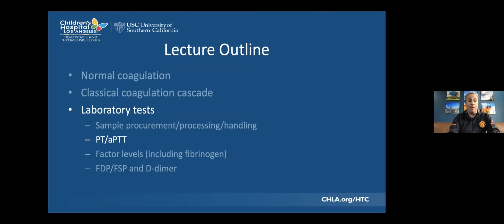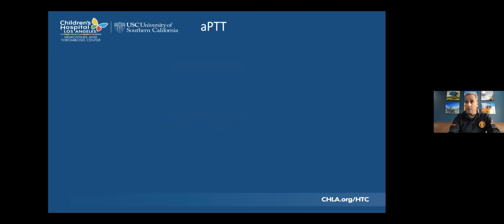Okay, so let's talk about the PT and the PTT. How are these actually done? So, as hematologists, we sometimes like to call it the APTT, although everybody calls it the PTT for short. A, because it's activated. There was a test called the PTT years ago, like 40, 50 years ago.